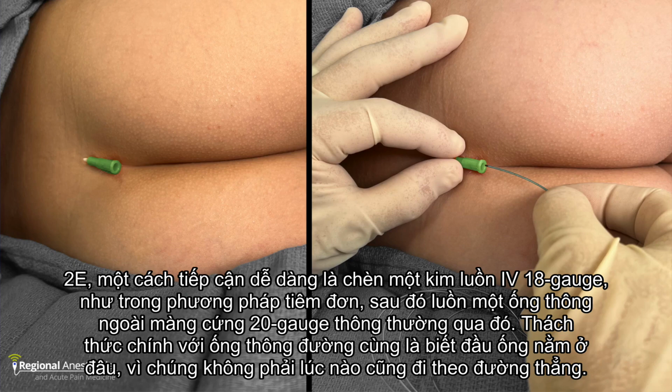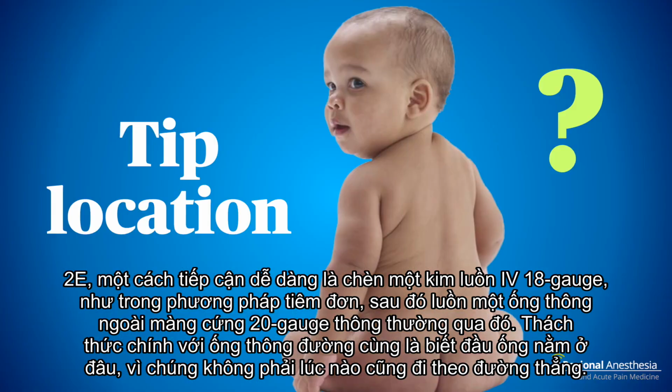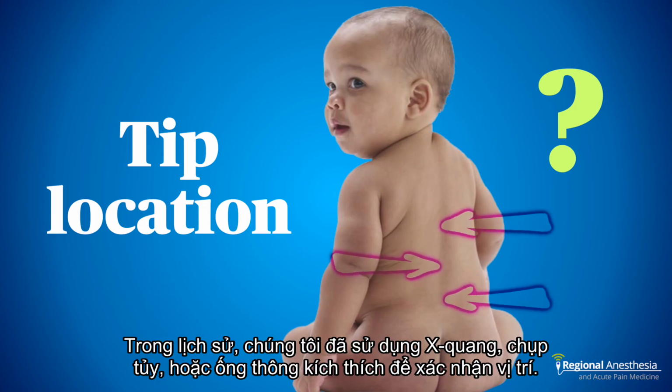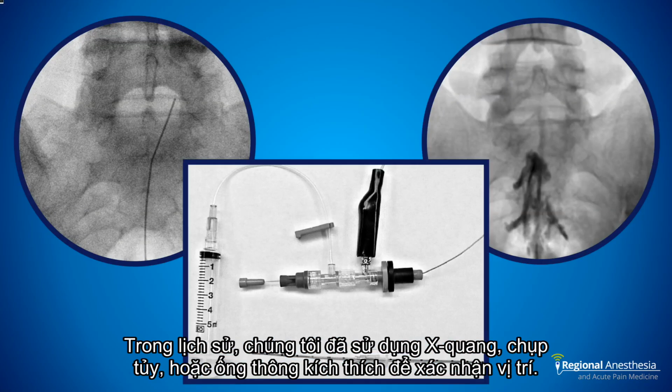Rather than use a stiff Tuohy needle, an easy approach is to insert an 18-gauge IV cannula, as in the single injection method, then thread a regular 20-gauge epidural catheter through that. The main challenge with caudal catheters is knowing where the tip is, because they don't always go in a straight line. Historically, we used x-rays, myelograms, or stimulating catheters to confirm placement.